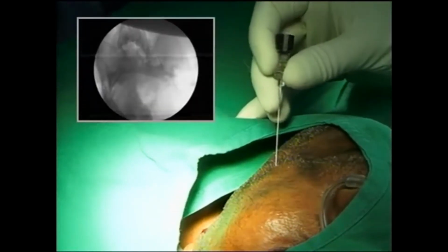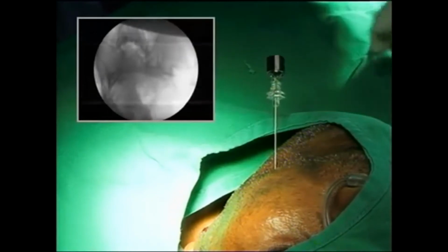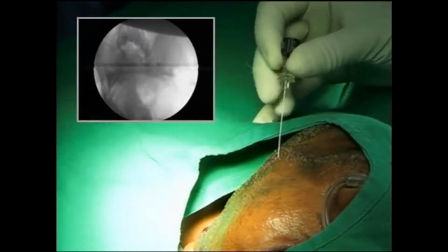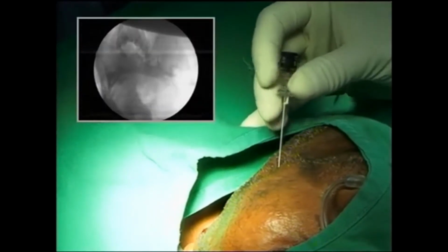Now the bend is not along the bevel, so I'm getting confused out here. Oh, the bend is the other way. Yeah, the bend is, I think, opposite direction.